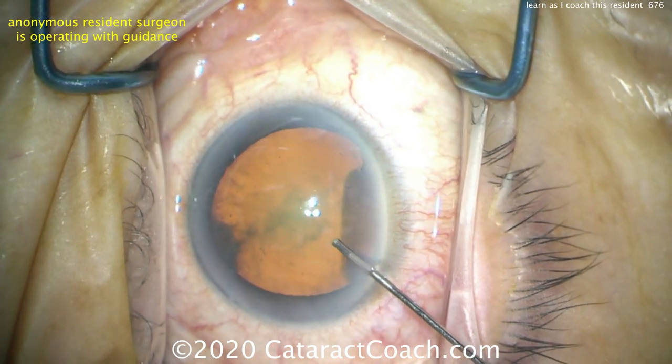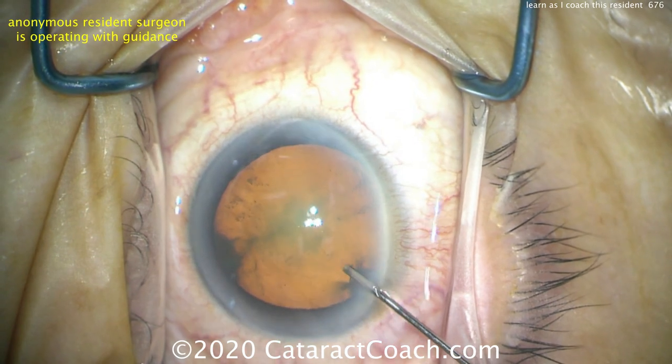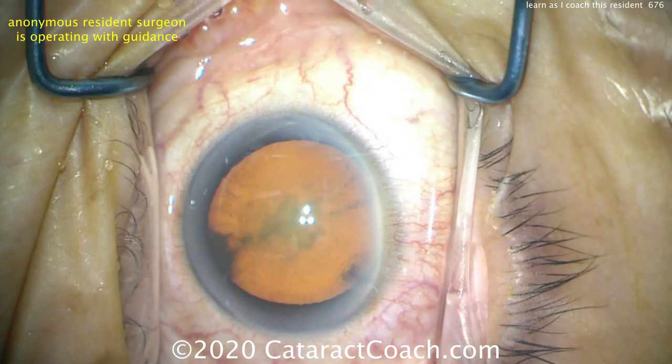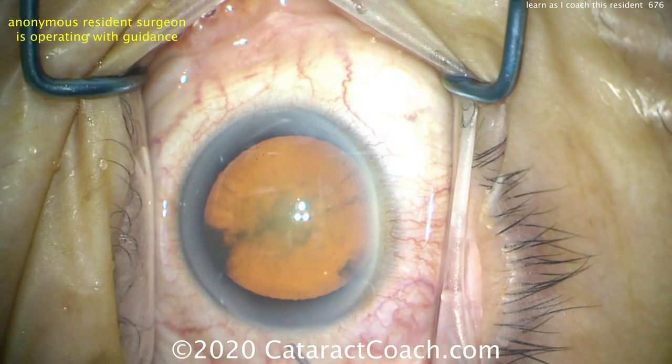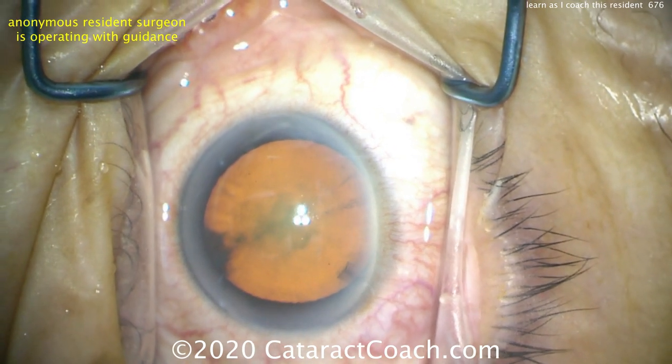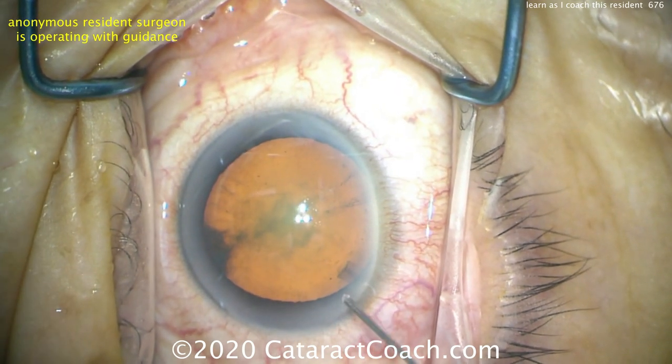You may have guessed by that paracentesis that this is a left-handed surgeon, and she's choosing to make the main incision with the left hand as well as place the phacoprobe through that left-sided incision. That's why the paracentesis is here on the right side. Left-handed or right-handed doesn't really make a difference.